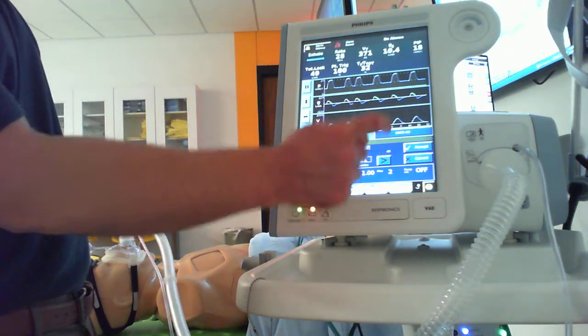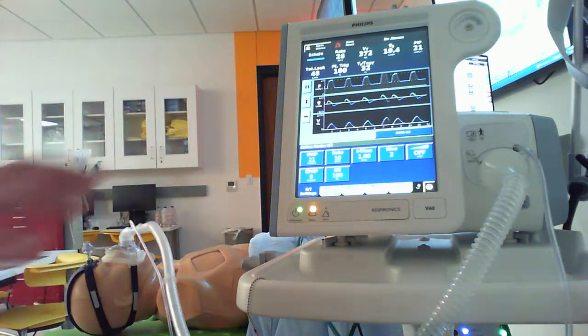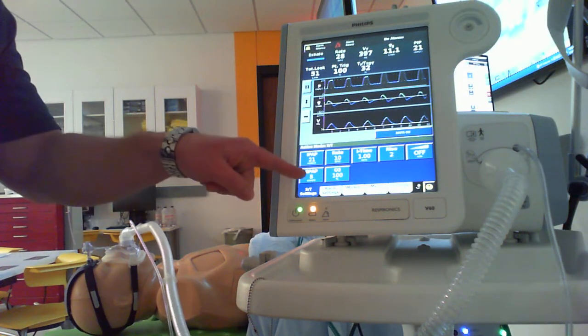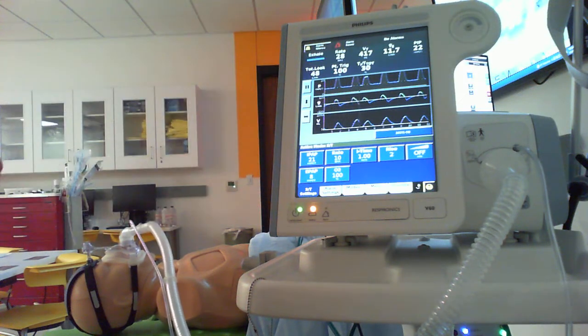So I need to maintain the same difference, because I wanted to maintain my acid base, my ventilation, my tidal volume, respiratory rate, all that stuff was looking good. So as I'm changing my baseline to improve oxygenation, I've got to think about the impact on my pressure support.